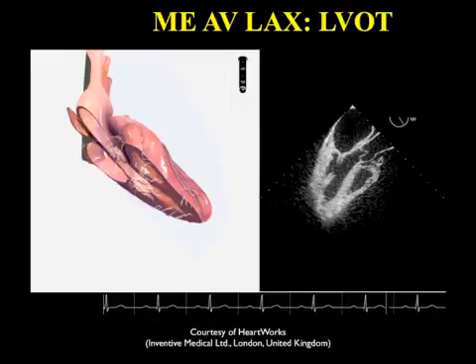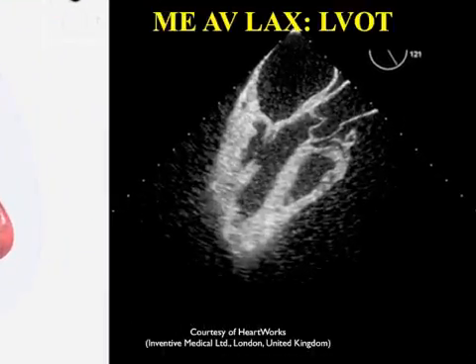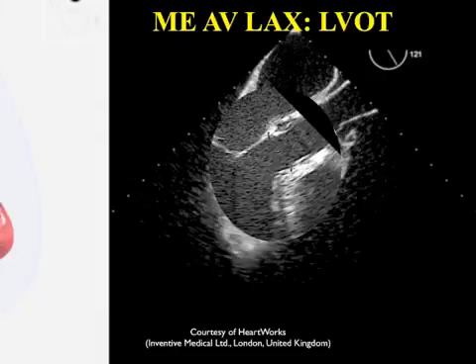The LVOT should be measured while the valve is open and the walls appear parallel to each other. The measurement should be within 1 centimeter of the valve.